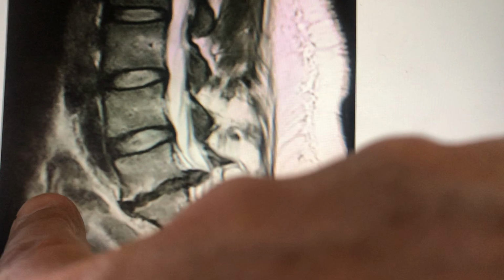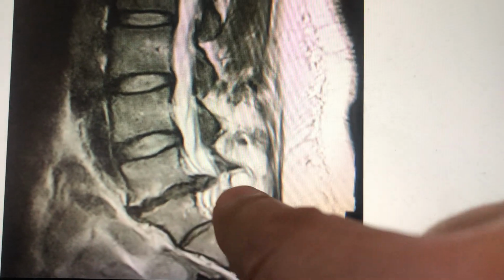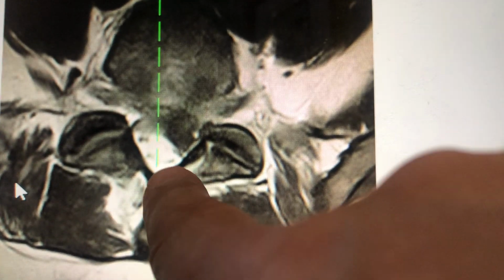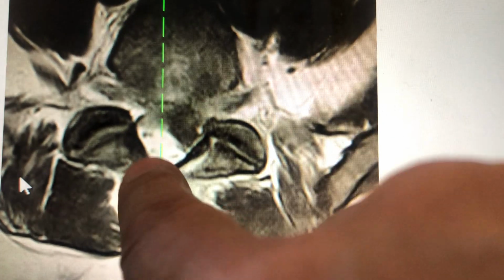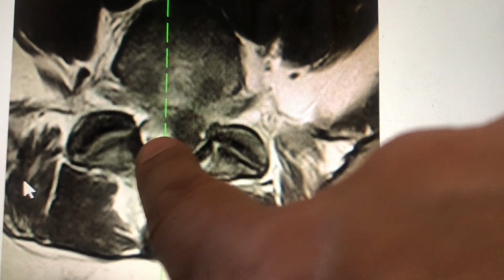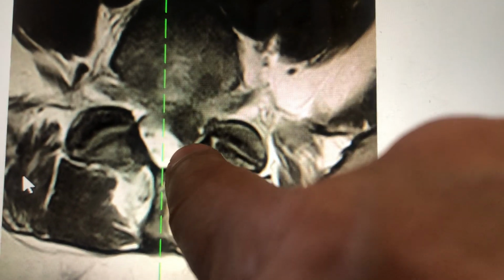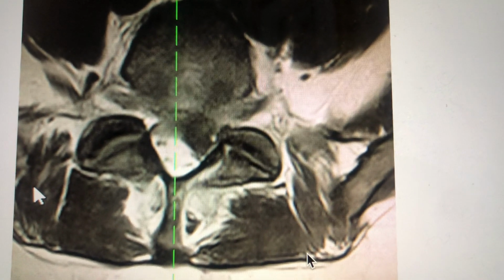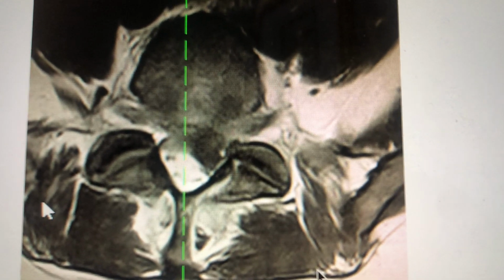We're going to go now to a cross section. If you cut across here and look down, you can see this in cross section, and that's what this image shows. You see the white material? The white area there is what the whole thing should look like. All this here should be white, but there's dark tissue there and very dark tissue there. This is all disc fragment material that should not be there. On a scale of 0 to 10, I would say the severity of that relative to what we usually see in disc herniations is probably a 7, something like that.